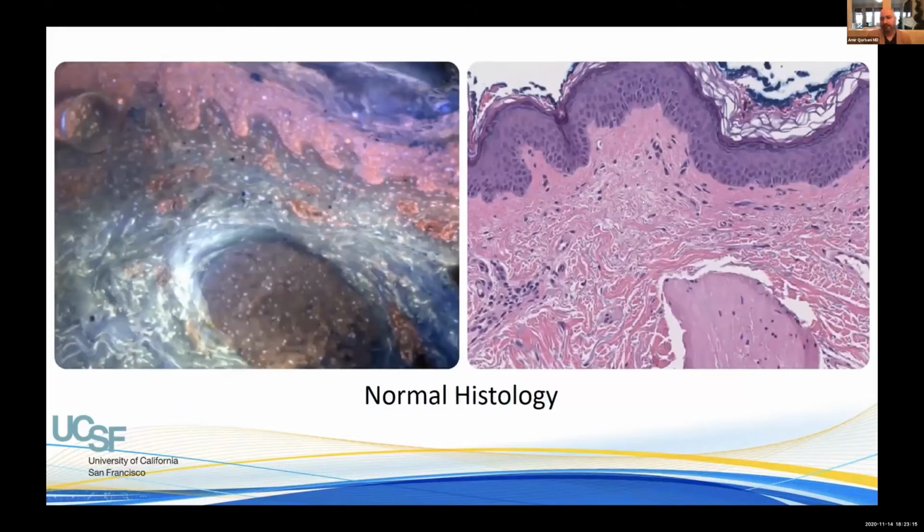For example, the right side is the normal H&E. Normally, when we cut the tissue traditionally, we have to stain it with hematoxylin and eosin, H&E stain, and it usually has red and blue, two colors. But fluorescence can generate multiple spectra of visible light. As you can see, the left side has multiple colors. Each color represents a material. For example, the brown at the bottom of the picture is muscle, and the right side is comparable to the H&E.